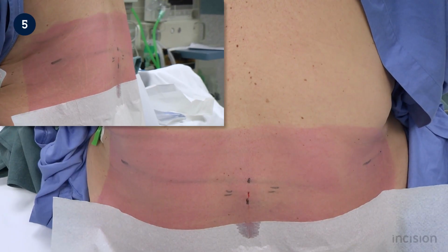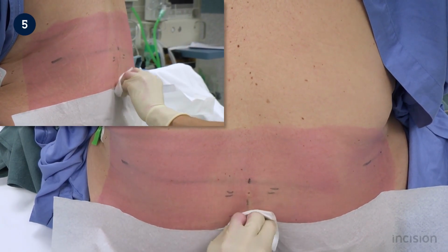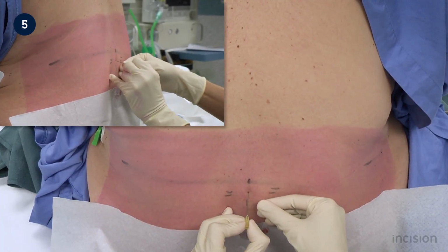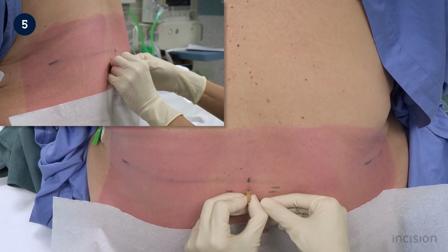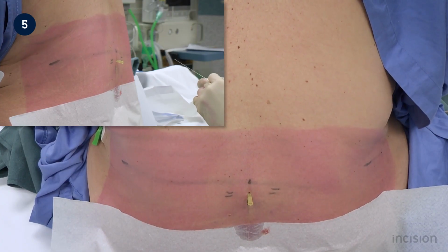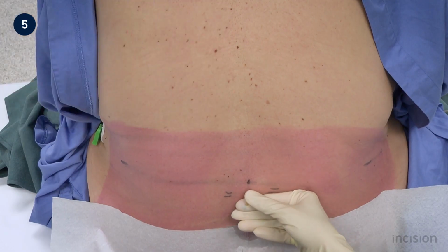Bleeding from the skin is common and can be dealt with using a sterile gauze swab as now shown. The spinal needle introducer is now inserted into the skin and underlying subcutaneous tissue. Before insertion of a spinal needle is demonstrated, it is important to note that the anaesthetist is left-handed. To insert the spinal needle, the non-dominant hand is positioned against the patient's back as follows.